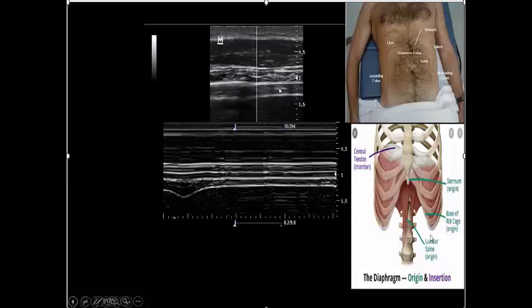I need to measure the thickening of this costal part of the diaphragm. I will place the M-mode cursor 0.5 to 2 centimeters from the junction between the liver below and the lung above. With inspiration the diaphragm will thicken, and I will determine this degree of thickening as a measure of diaphragmatic strength, which is a very specific and sensitive sign in the ICU.